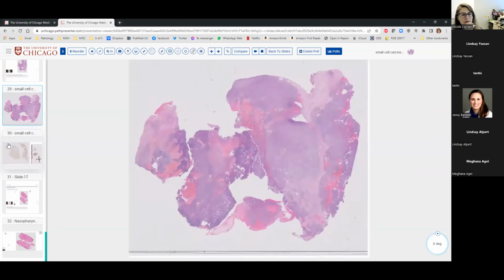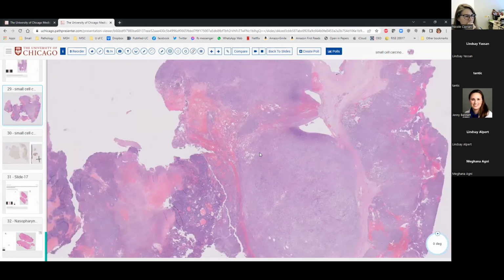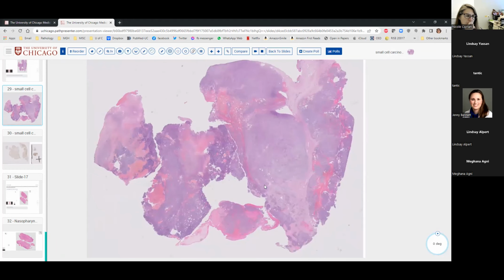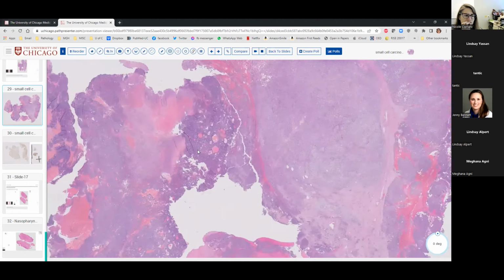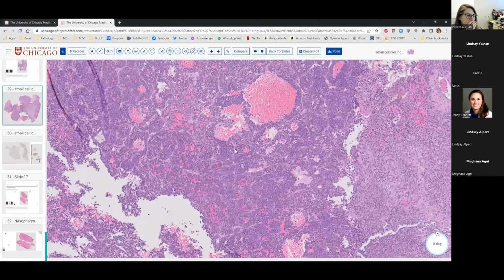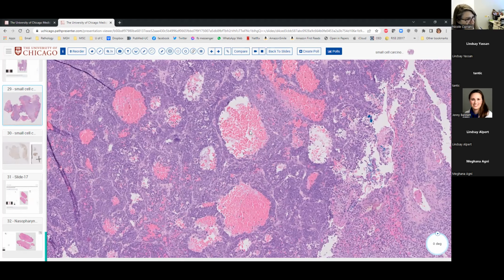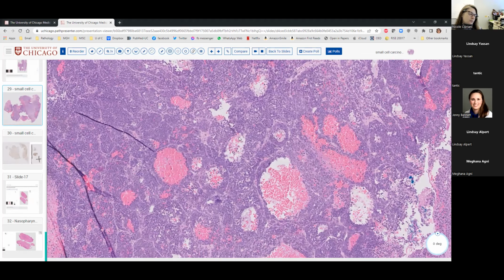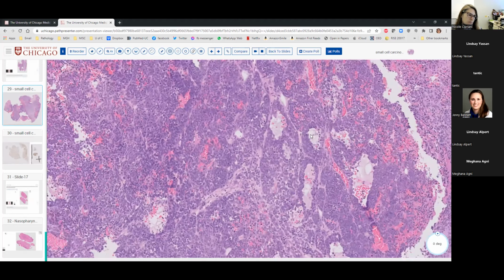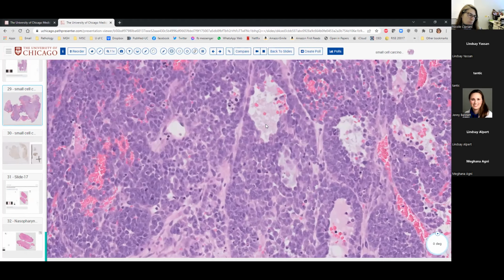We can see here we don't have normal ovarian parenchyma at all. On the left there's some tumor cell necrosis, and it's a very hypercellular blue mass on low power. Zooming in, we can also see these cystic or follicle-like spaces. This is very classic for this entity. Normally, they have some eosinophilic material within them. Occasionally, it can be a little more basophilic, but I think this is still eosinophilic.